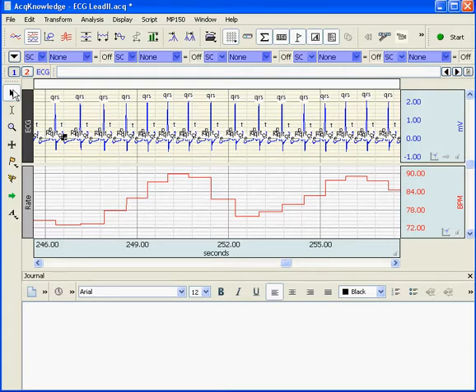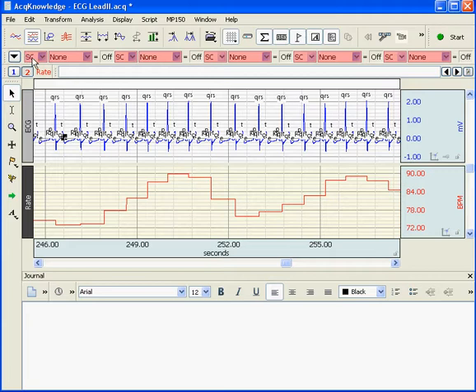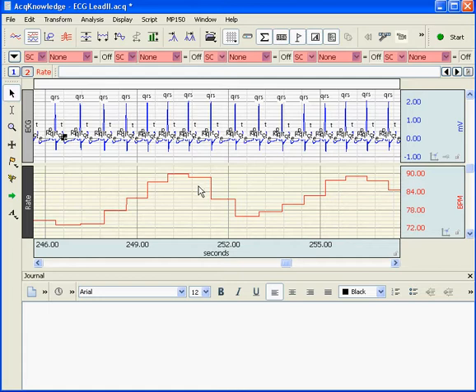As we look at this graph, you can see that one of the channels has a yellow background. By clicking backwards and forwards, we can see that the yellow highlighted area moves from one channel to the next. That allows us to identify the selected channel. SC refers to selected channel, so right now channel 2, which is heart rate taken from our ECG channel, is the selected waveform.